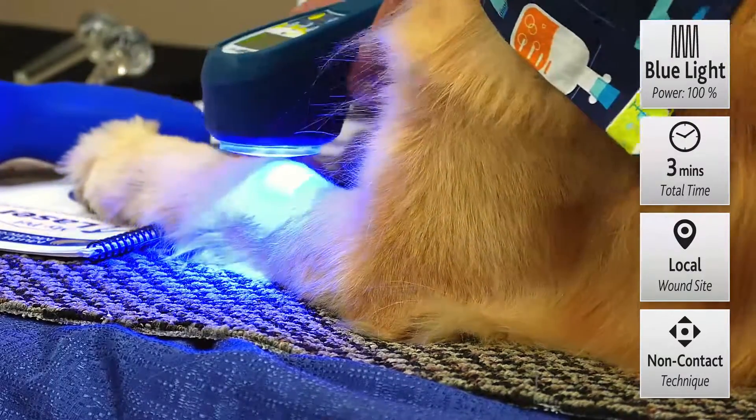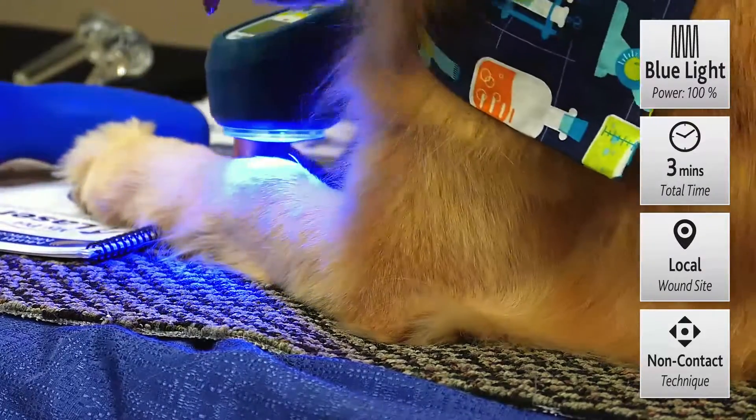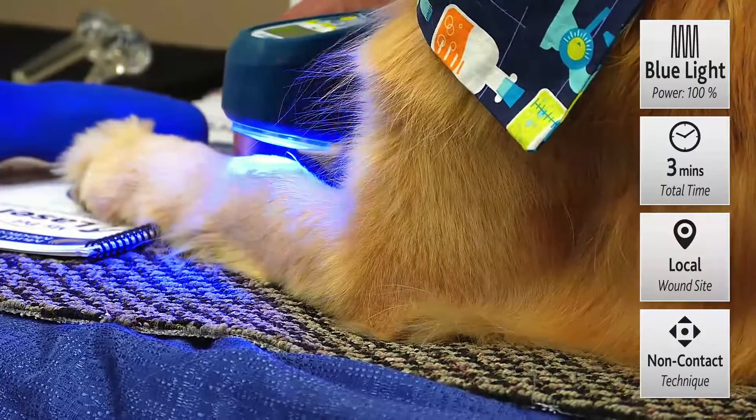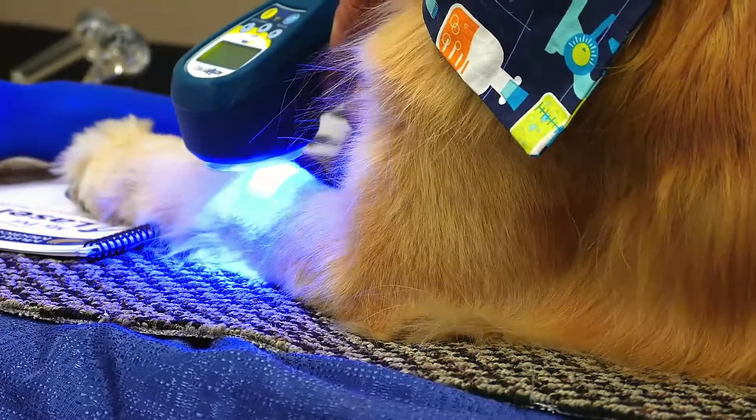Just scanning over it for about two minutes is good. If you can do it twice a day, that's great. If it's only once a day, that's very helpful. But make sure you give it enough of a loading dose to really get the lethality of this wavelength working for you — just enough exposure.